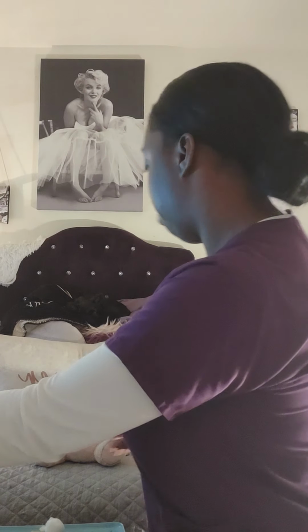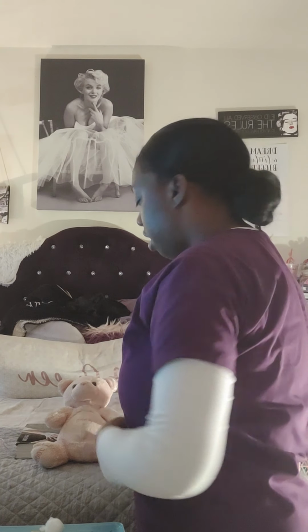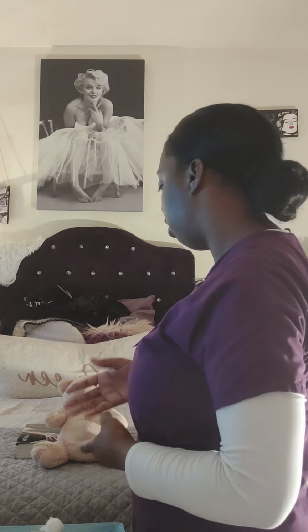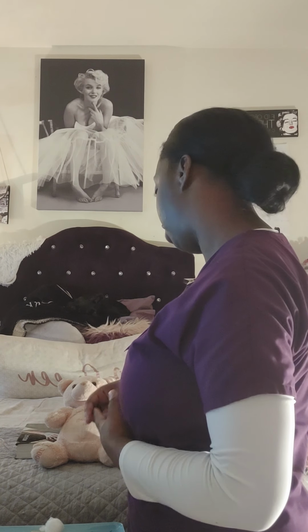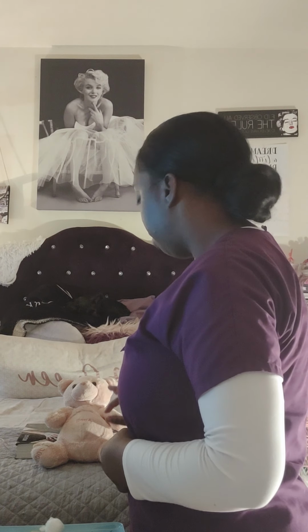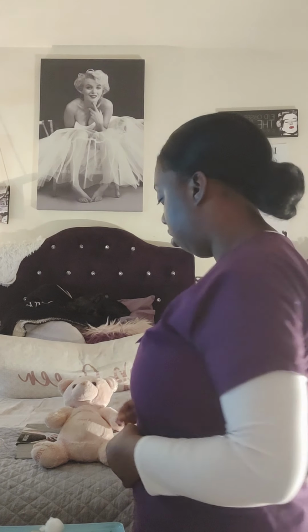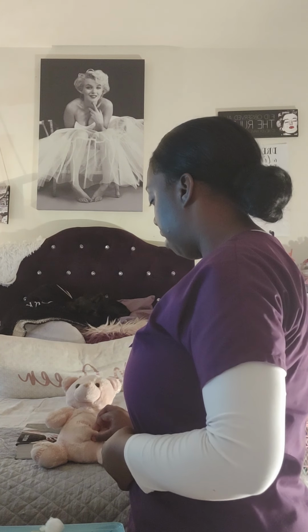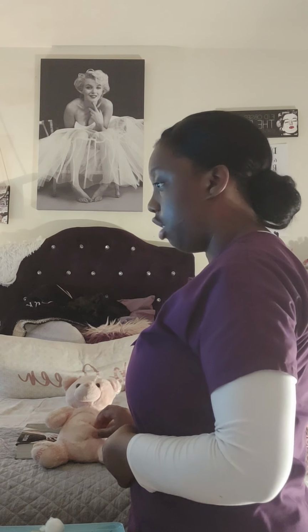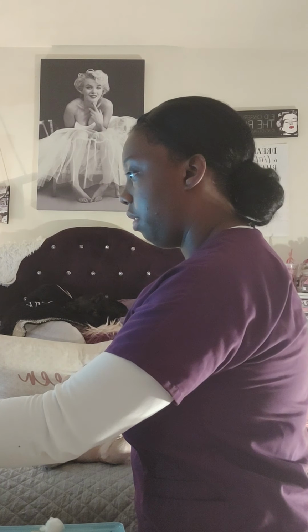Alright, so I'm going to move her clothing if she has any to expose the site. We're inspecting it for lesions, for trauma, for inflammation, and any bony prominences. So we're going to locate the area that we're going to give the injection at. It's subcutaneous, so we do it in the stomach. It's a good tissue to do it at. You guys can see it.